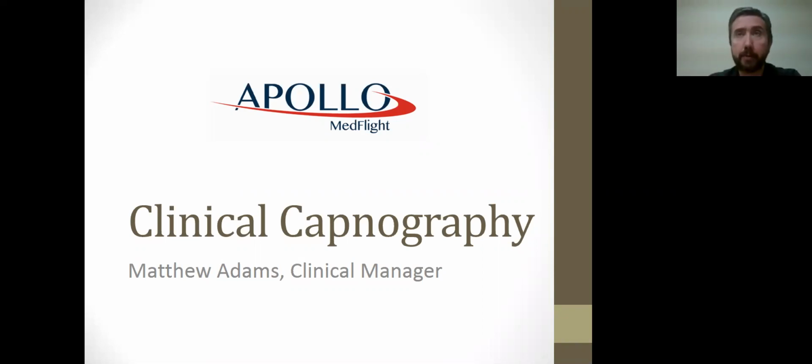So we're just going to get right into clinical capnography. When you think of capnography, typically we think of a ventilation vital sign or an airway management tool. We've heard the term shark fin, endotracheal tube confirmation, and so forth, and we shouldn't minimize those, but capnography is going to go a lot further than that. It can alert us to perfusion and metabolic problems. Yes, it's a device that we place in the airway as a measuring tool, but it's going to measure a byproduct that goes a lot deeper than that.